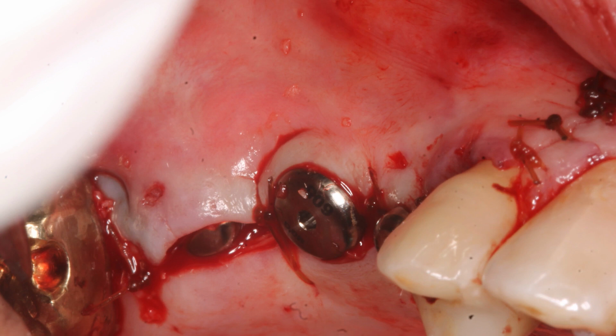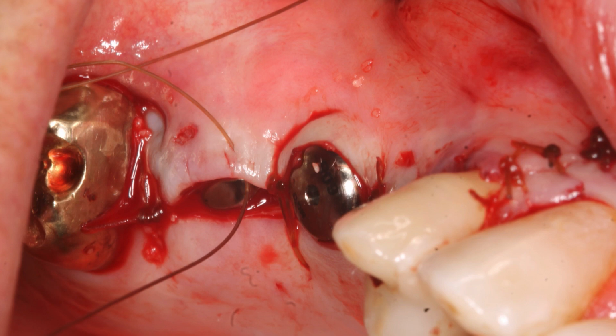So the suture, depending on how the bite and how much tension, the direction, the position of the bite, all of these will determine whether the flap edges will rise on top of the healing abutment or sit on the side, which is the preferred way. So let me quickly describe what I have coined the turtleneck suture technique. We've been talking about this for quite some time. I will have a separate video on this made available to our members.